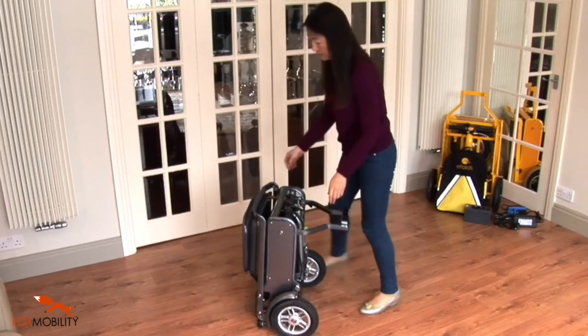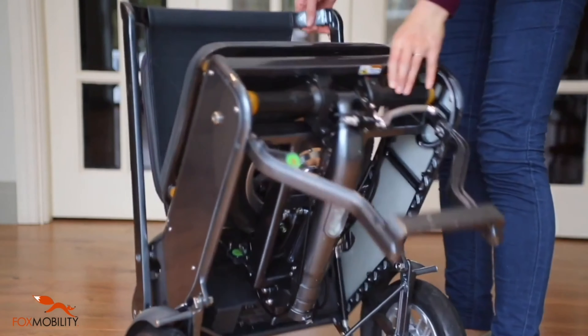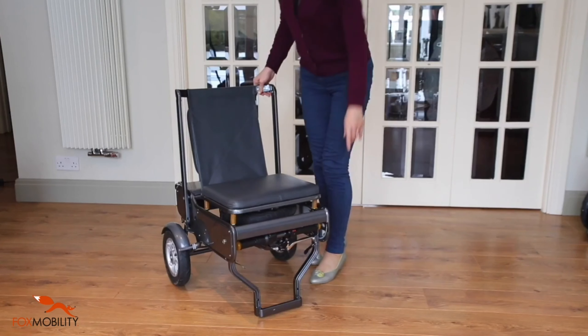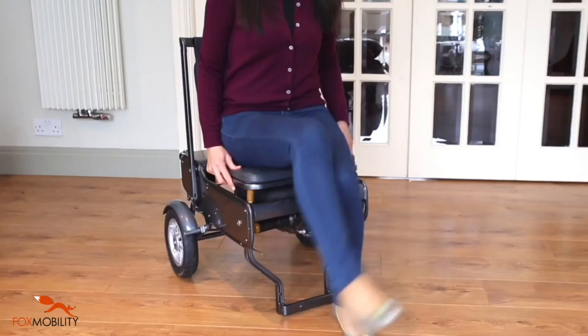Whilst keeping the rear wheels supported, lower the front stand to the ground. Raise the seat's backrest. Now you can rest comfortably on the eFoldie chair.